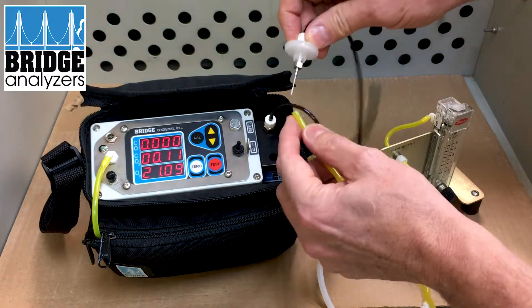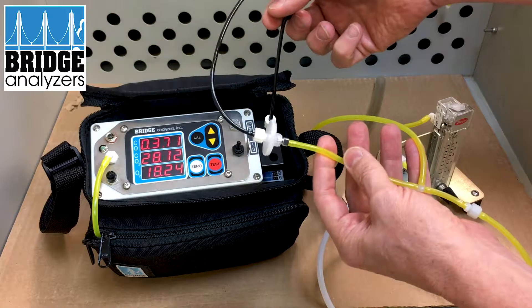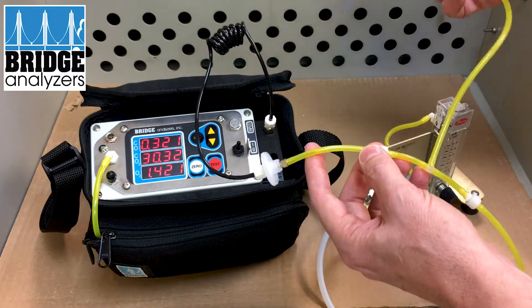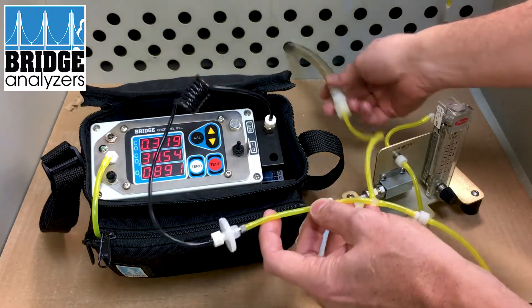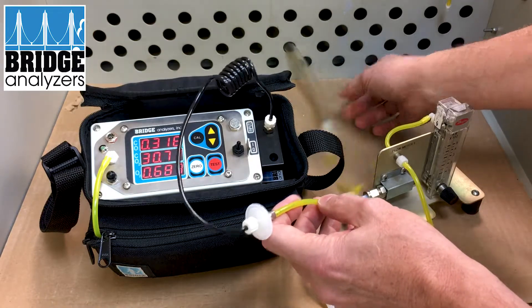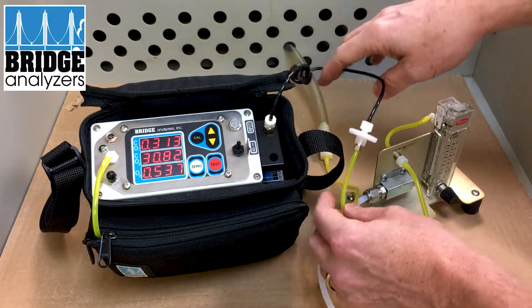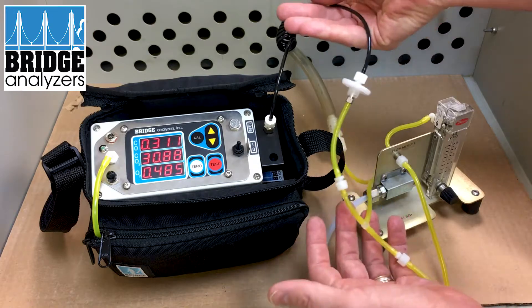I have the gas coming through here with a T-fitting for the overflow. When I plug in and attach the needle to the gas line, the analyzer will draw as much as it needs, and then the excess will go as an overflow to waste. In our office we have an exhaust vent, so we're drawing the excess out of the room. The analyzer is only pulling the gas that it needs.